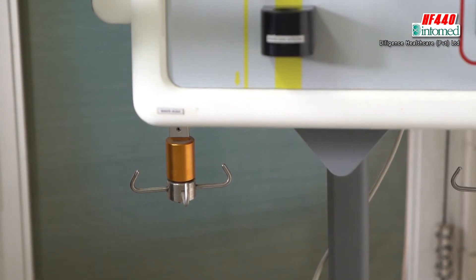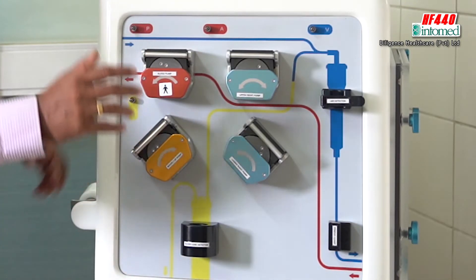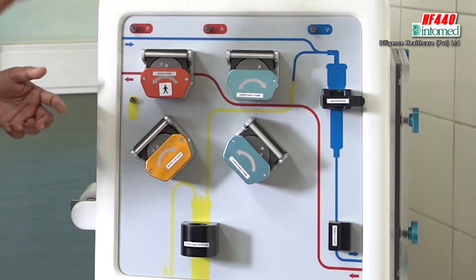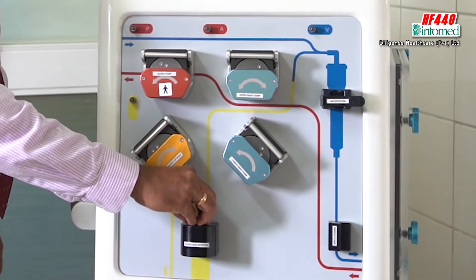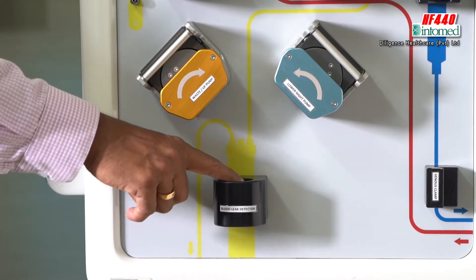If, because of any reason, this particular filter is damaged and blood is coming out through the UF line, it comes here and detects it then and there, giving a message: 'blood in UF line.' That particular message comes and then stops the machine also. That's a very important security feature of this particular machine.